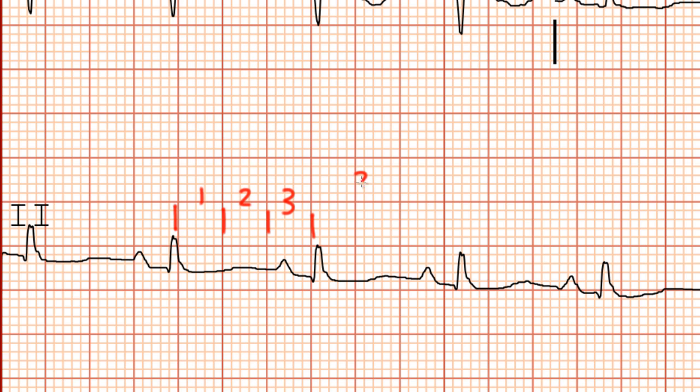Thus, our heart rate is 300 divided by 3, or approximately 100 beats per minute. Let's say we had four boxes between consecutive QRS complexes. Well, in that case, our heart rate would be 300 divided by 4, or 75 beats per minute. And if you had five large boxes between consecutive QRS complexes, then your heart rate would be 300 divided by 5, or 60 beats per minute. Trust me, I'm going somewhere here with this.